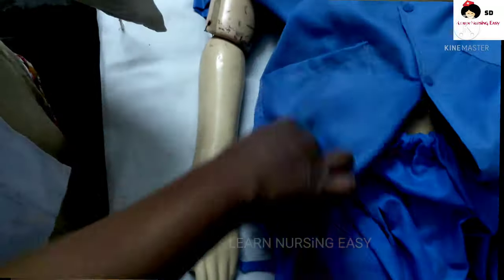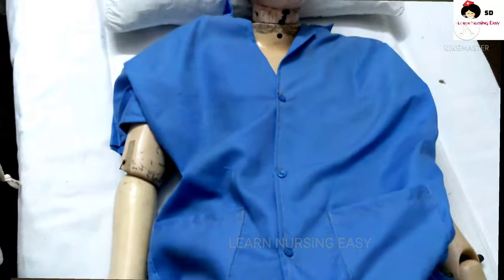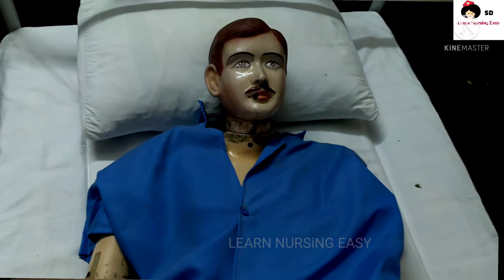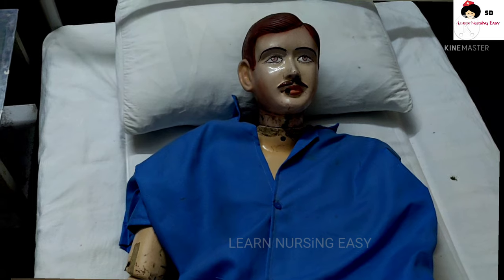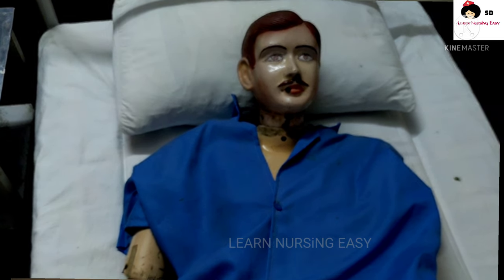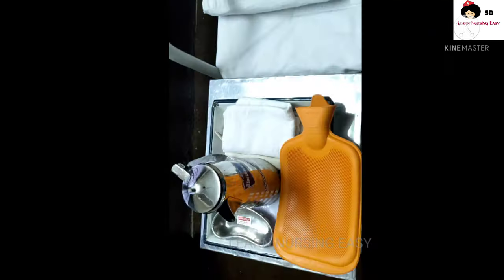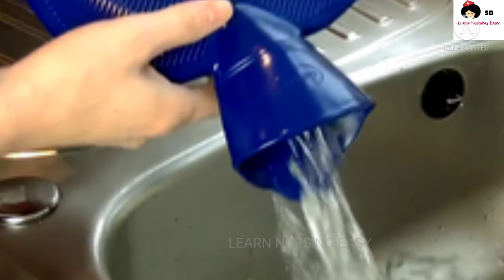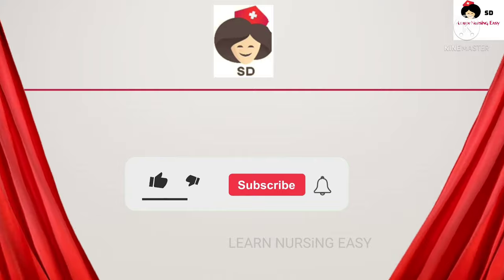After the procedure, ask the patient whether he is comfortable and whether the pain is relieved. Do not leave the hot water bag near the patient's bedside as it can cause injury and burns. Take the tray back to the utility room, empty the water in the sink, dry the hot water bottle upside down, and replace all the articles.